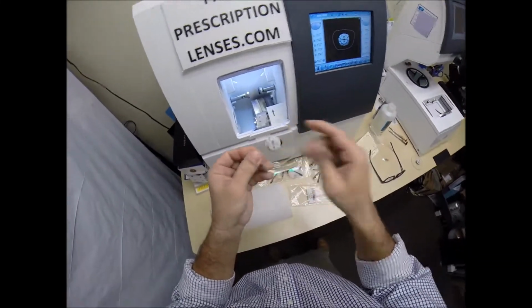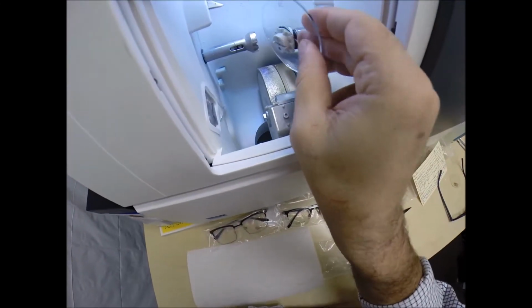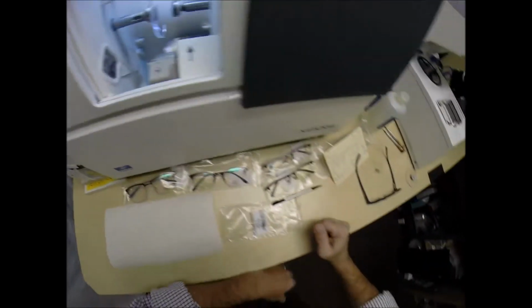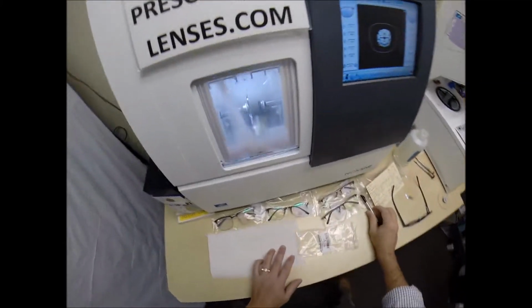So now the magnet is going to do its job a second time. It's going to attach itself to another magnet here in the chuck, or as I like to call it, the Charles, because I don't know this machine well enough to call it Chuck. Yep, same bad jokes. I'm going to hit the green arrow, which is start in every language.